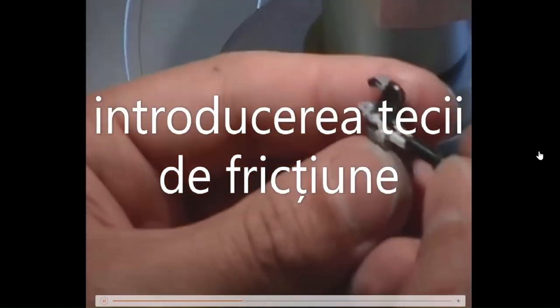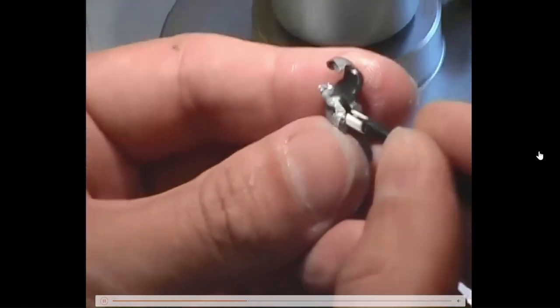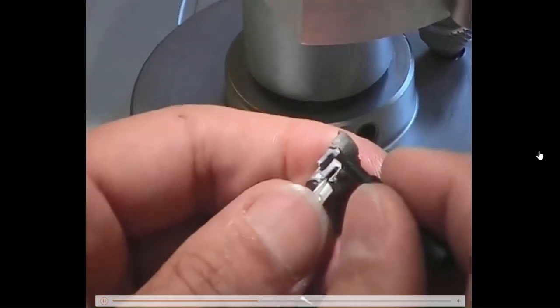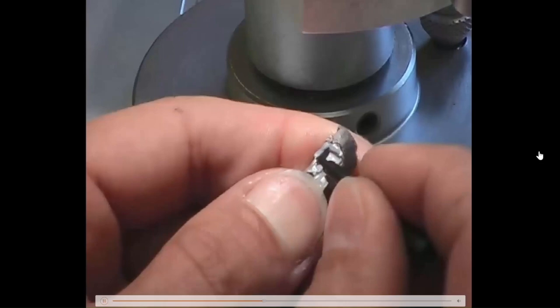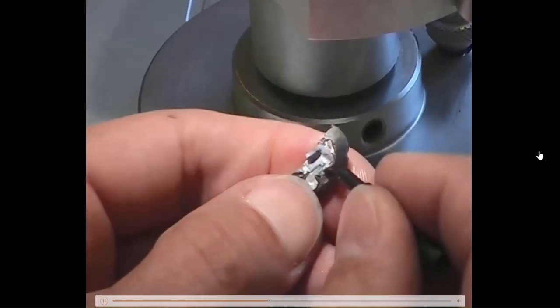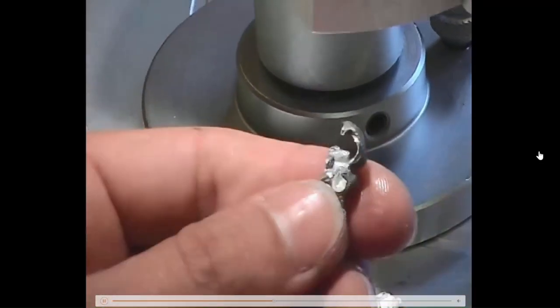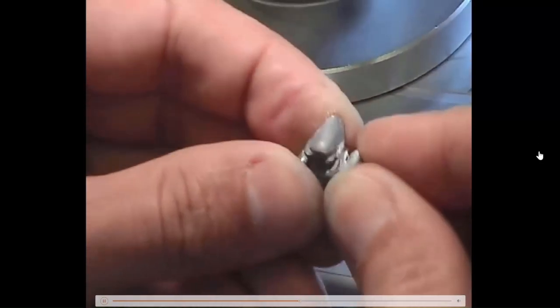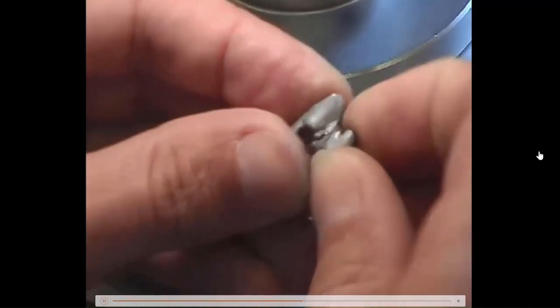Now I introduced the retentive element, plastic retentive element. This white one was just for the purpose of working in the lab. Otherwise we had red or blue according to the amount of retentive force that we wanted to get. And now I tried to put it in. It goes quite well, not perfectly.